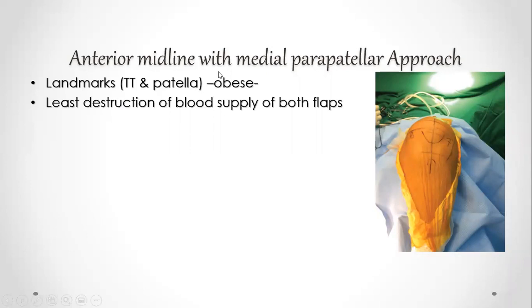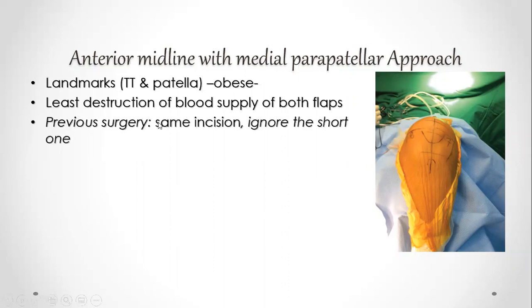So the main part is what we call the anterior midline, which has the least destruction of the blood supply, as we saw in the previous picture, in both flaps. Okay. If you have a previous surgery, use the same incision, the same midline.